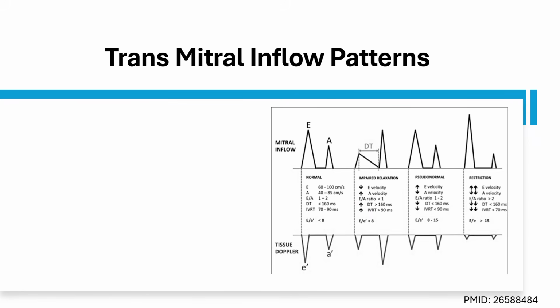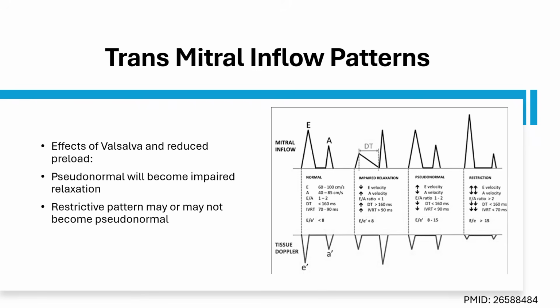Impaired relaxation is typically followed by a pseudonormal pattern where you have left atrial pressure increase. That is why, because of the gradient between the left atrial pressure and LV, you have predominantly E filling during the early stage of diastole, which is typically followed by restrictive type of diastolic dysfunction, where you have E to A ratio at least 2:1 or higher.